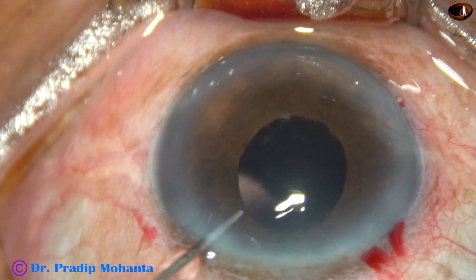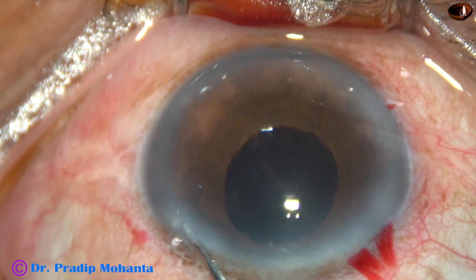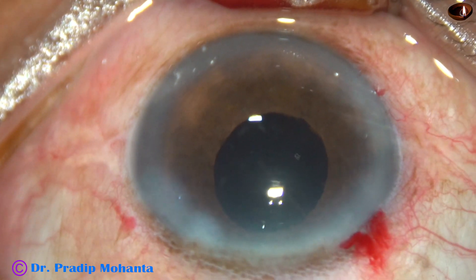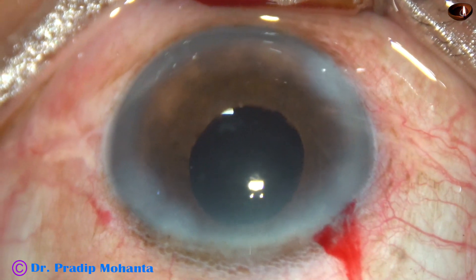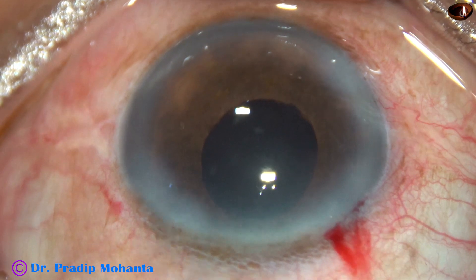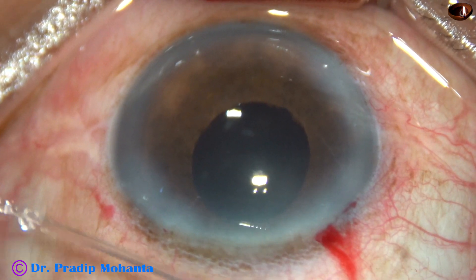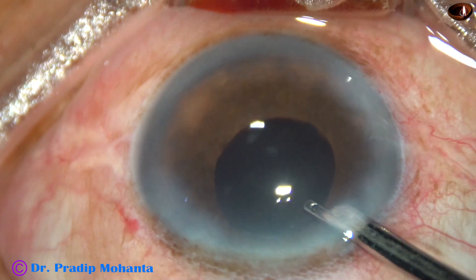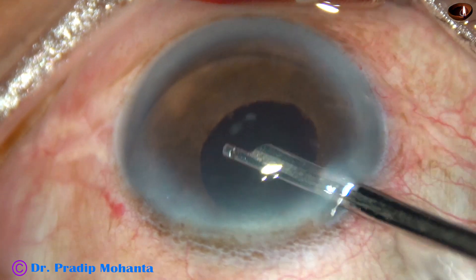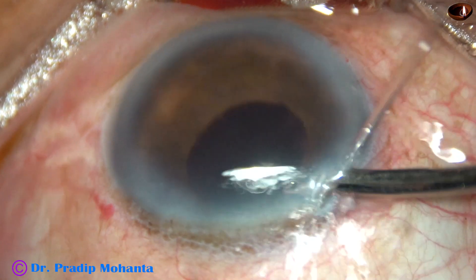Now a bit of moxifloxacin is injected. The side ports are closed by corneal stromal hydration — BSS is injected into the corneal stroma on either side of the stab incisions and these wounds close. This is the final lavage of the anterior chamber. I do this religiously in all cases. The incidence of toxic anterior segment syndrome (TASS) is nil in my cases.